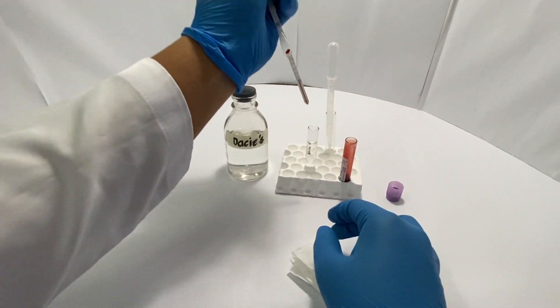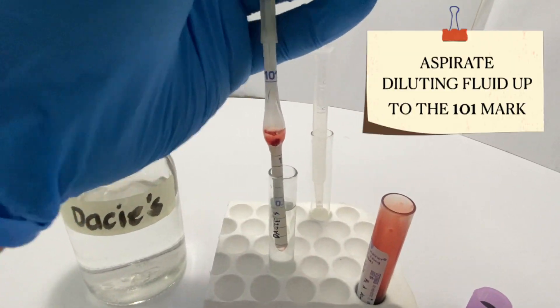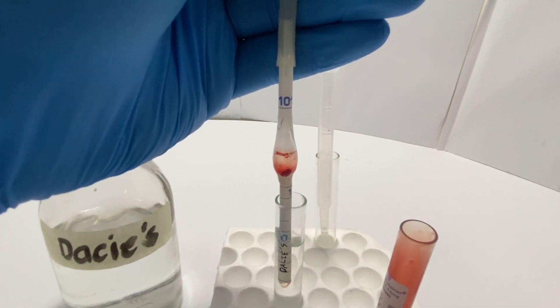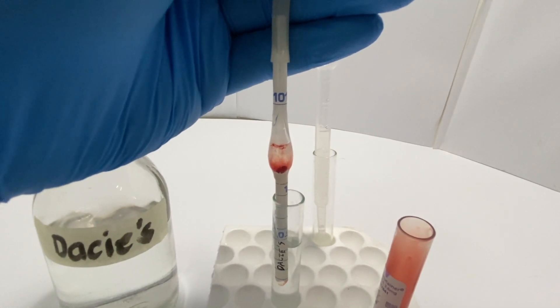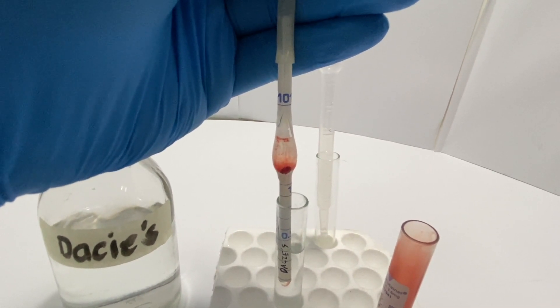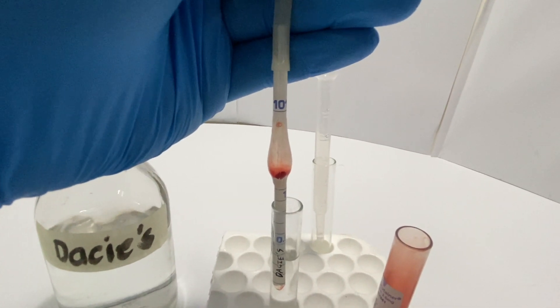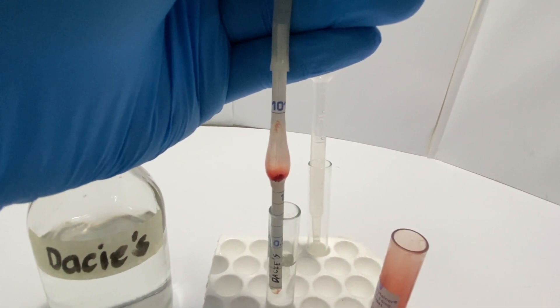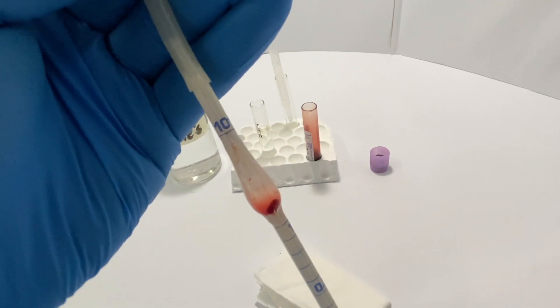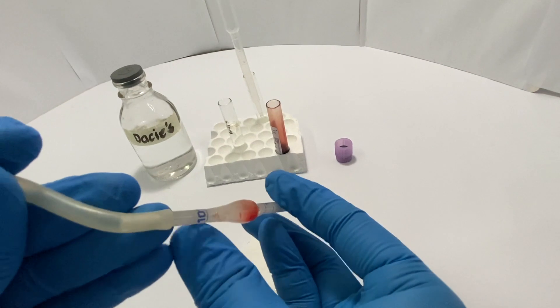After, immediately place the pipette with your blood sample into the tube with diluting fluid. Slowly pull the plunger of your syringe to aspirate diluting fluid into the Pharma pipette. Do this carefully so that you will not go past the upper marking of the Pharma pipette, which reads 101. Once you have collected the necessary amount of diluting fluid, slowly take the pipette out of your tube.